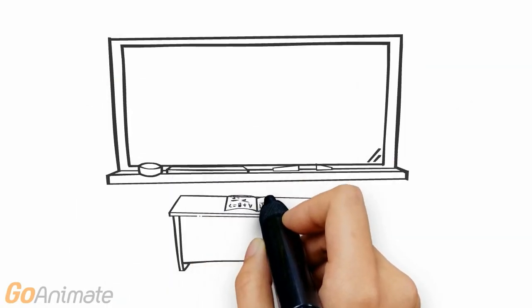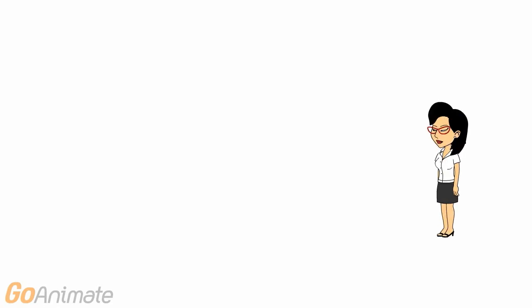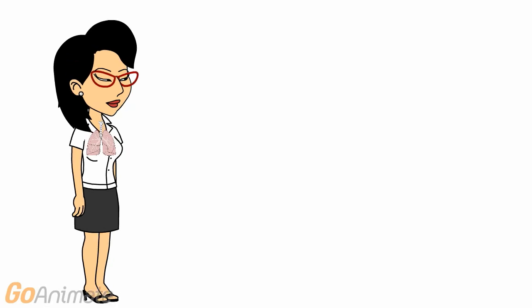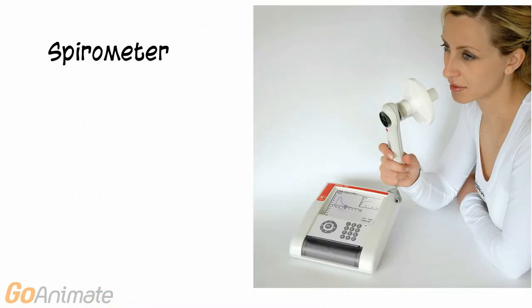Let's learn about lung volumes and capacities. The amount of air entering and exiting the lungs can be measured. Devices called spirometers can be used to measure lung volumes.